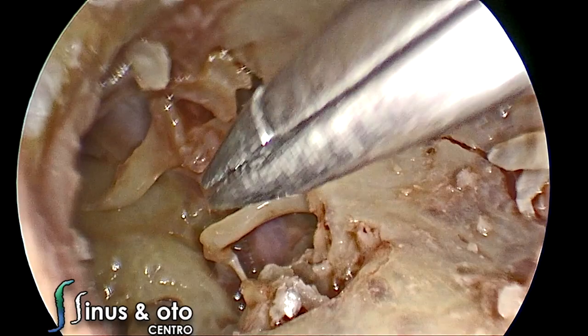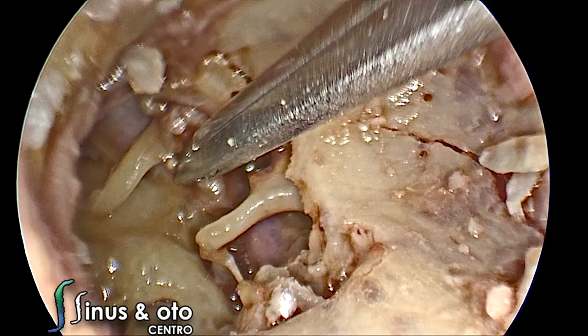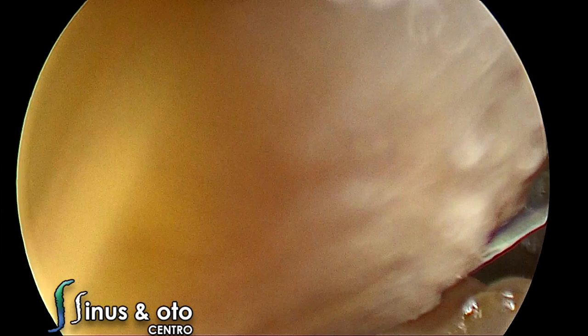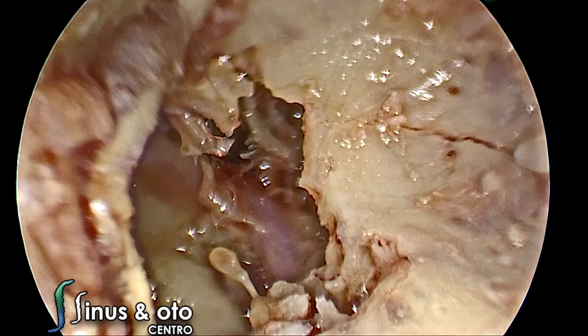Sometimes the removal is easy, sometimes it's a little more tricky — in this case I forgot to cut the tensor tympani tendon. We remove the malleus first, and then the incus. We can see the short process and long process of the incus. After removal, we have a very good view of the epitympanic diaphragm.